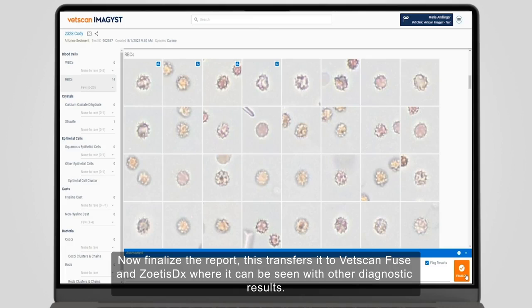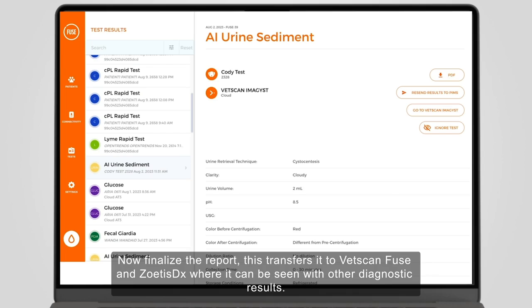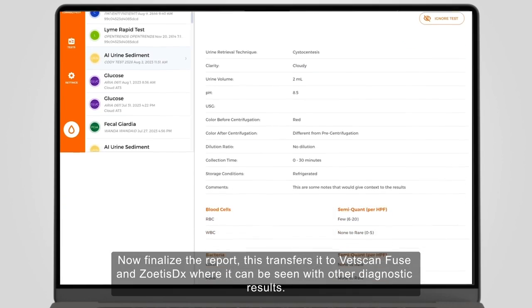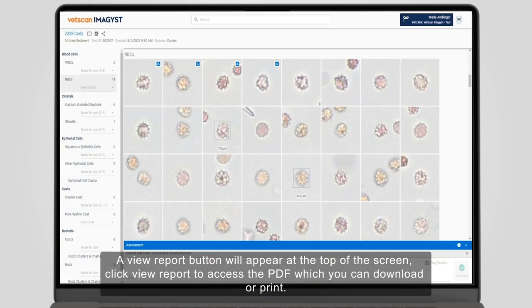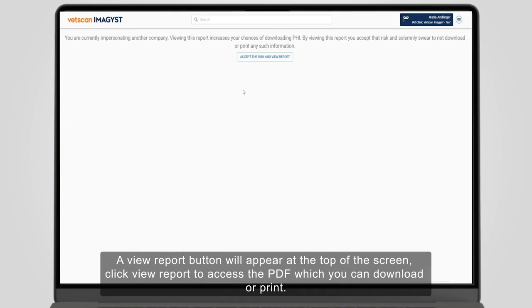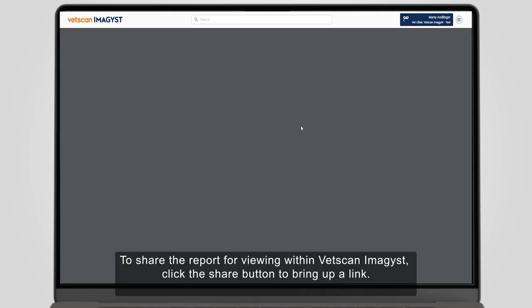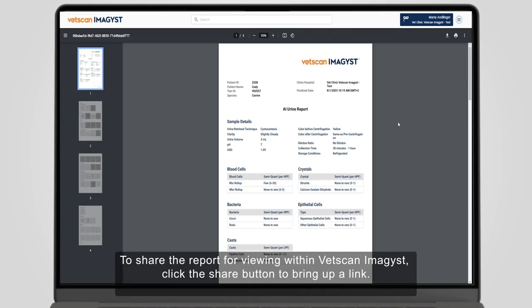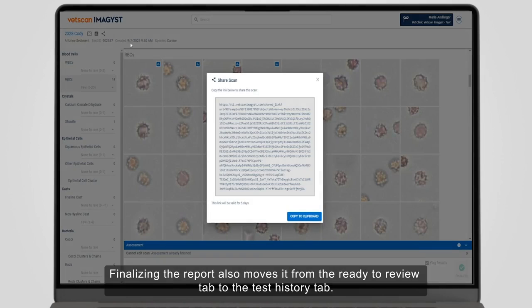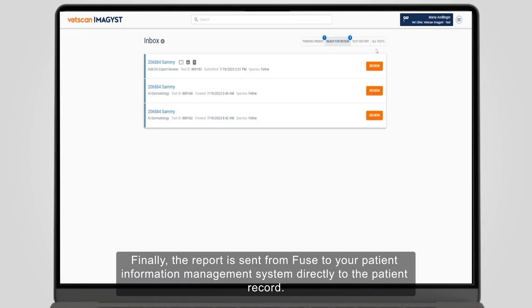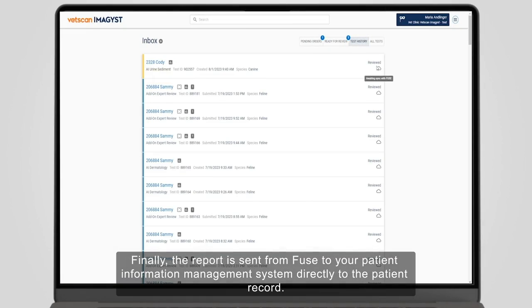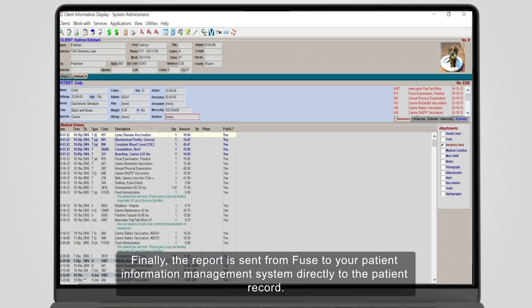Now finalise the report. This transfers it to Vetscan Fuse and Zoetis DX, where it can be seen with other diagnostic results. A View Report button will appear at the top of the screen. Click View Report to access the PDF, which you can download or print. To share the report for viewing within Vetscan Imagist, click the Share button to bring up a link. Finalising the report also moves it from the Ready to Review tab to the Test History tab. Finally, the report is sent from Fuse to your Patient Information Management System, directly to the patient record. This completes the test order.